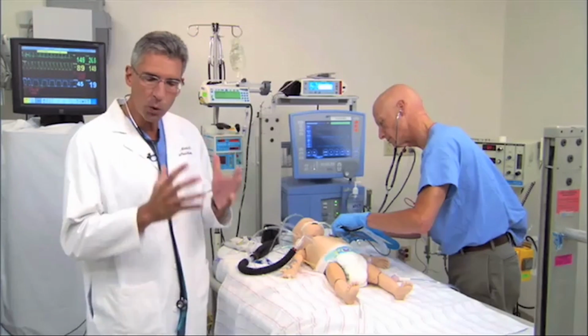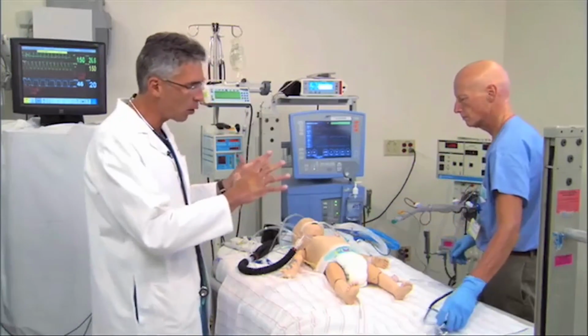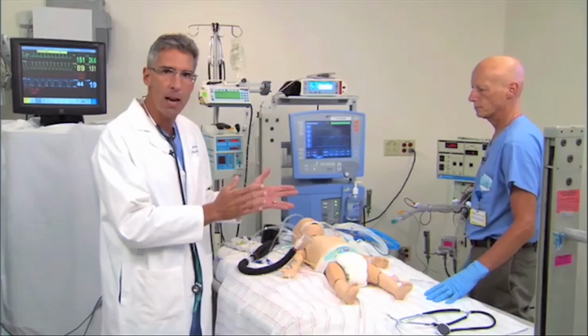Now, before transitioning to high frequency, I think it helps tremendously to get a thorough physical assessment of the patient's current respiratory status and hemodynamic status. So I'm going to quickly examine Samantha.